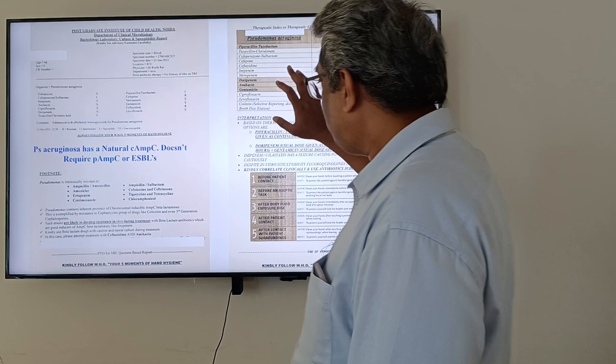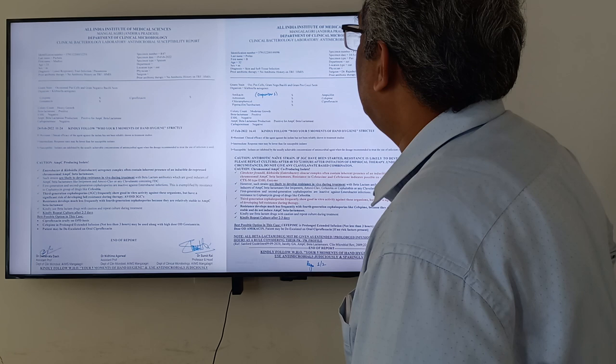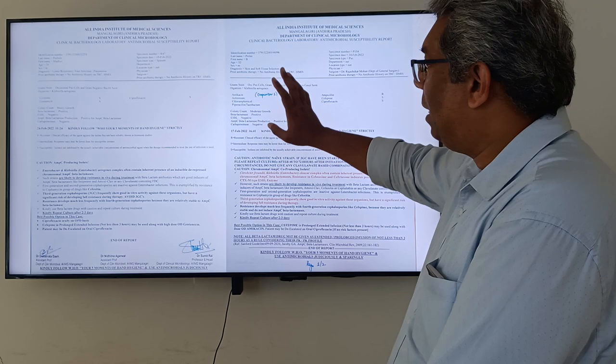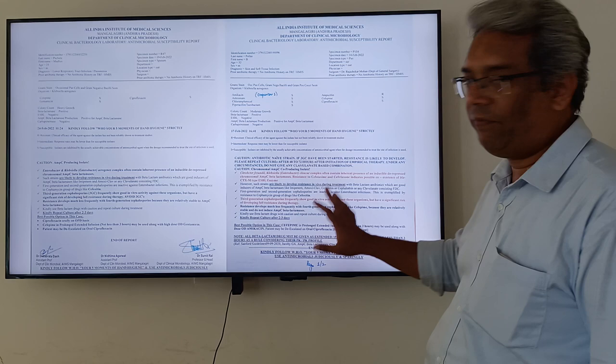This is actually the other report, this is mixed up. This is also another case of Pseudomonas aeruginosa, again from the neonatal ICU, same thing. This is a report of Klebsiella aerogenes that we isolated; we had two isolates, if you remember, of Enterobacter aerogenes. Again in this case we said this is Enterobacter aerogenes slash Klebsiella aerogenes, so it is likely to develop resistance during treatment. Therefore you have to avoid clavulanic acid based combinations, avoid drugs like imipenem, avoid third generation cephalosporins. Third generation cephalosporins will show good in vitro activity but have a significant risk of developing resistance in vivo.